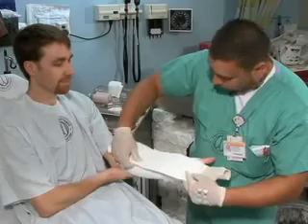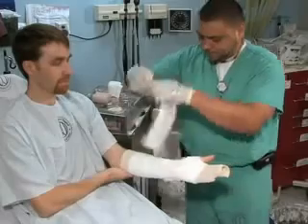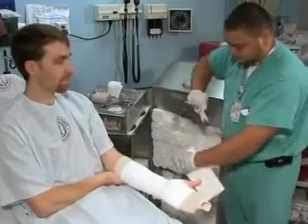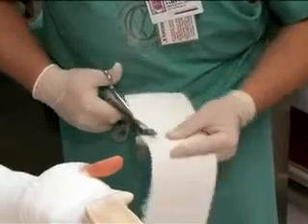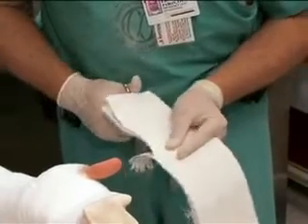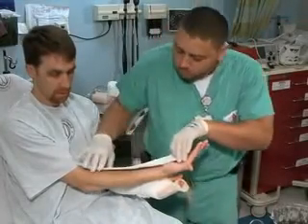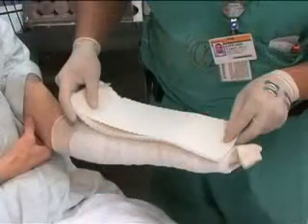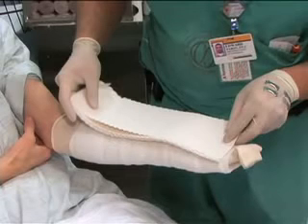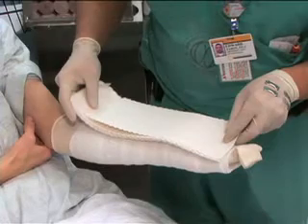Select a piece of dry plaster that is slightly wider than the limb to be immobilized. Measure the length of splint material required, then cut or tear the dry plaster to the appropriate length. Use at least eight layers of plaster material for upper extremity splints and twelve layers for lower extremity splints to provide adequate strength. Consider using the unaffected extremity to measure the required length. Use additional layers if extra strength is needed, keeping the total splint thickness less than 24 layers to minimize the risk of thermal injury as the plaster dries.